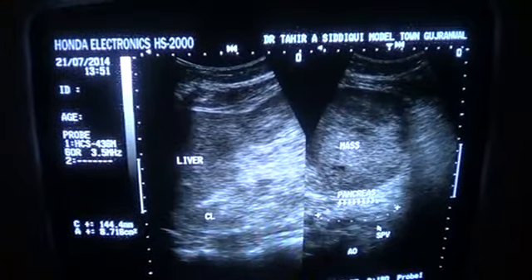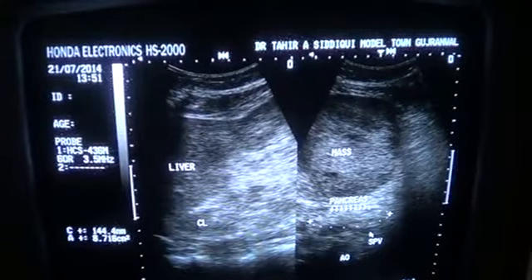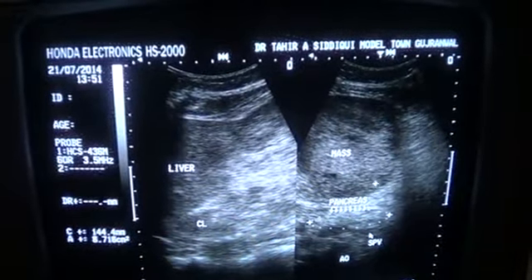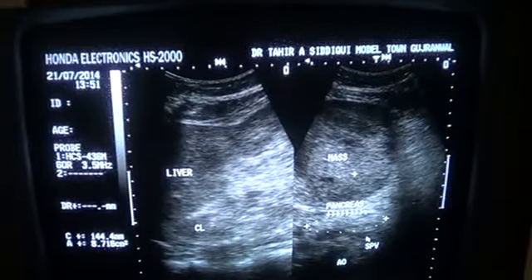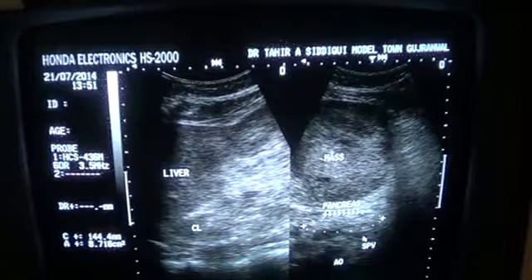Now this is an ultrasound study of a 60-year-old female presenting to me to rule out a mass felt in the epigastric region extending into the hypochondrium, right hypochondrium. Now you see this is the mass.